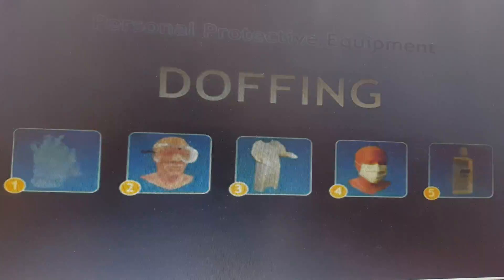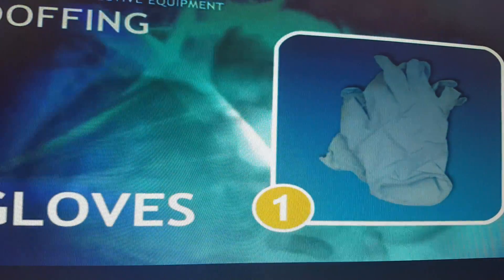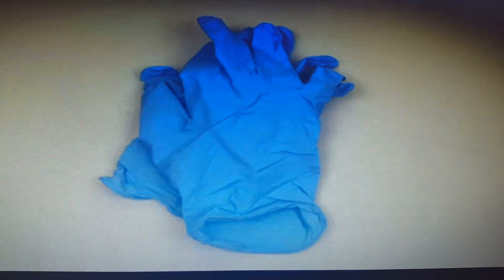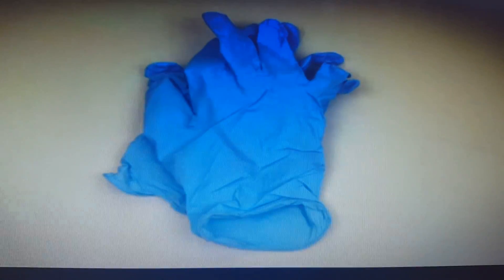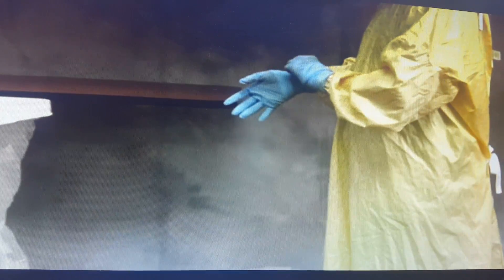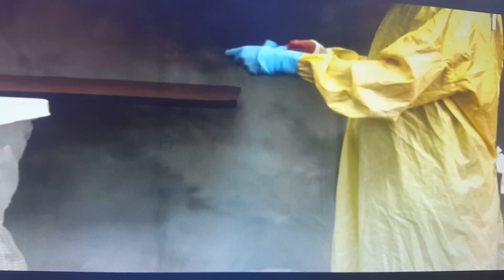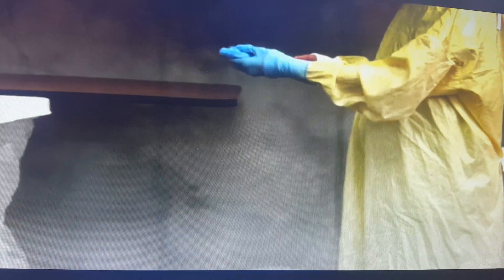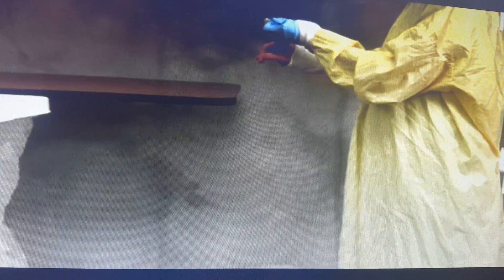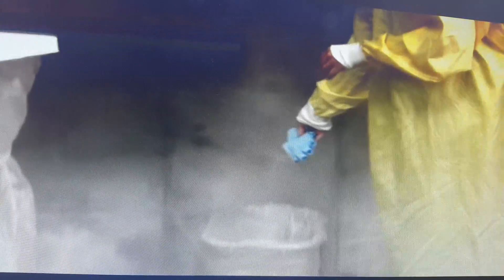Watching the video demonstration: the gloves are the most contaminated, so remove them first. Take care not to contaminate your other hand. You can see how she is removing the glove — she grips the outside surface, then her finger goes inside the inner surface because it is clean, to pull the glove off from the outside. Discard in the yellow waste bin.